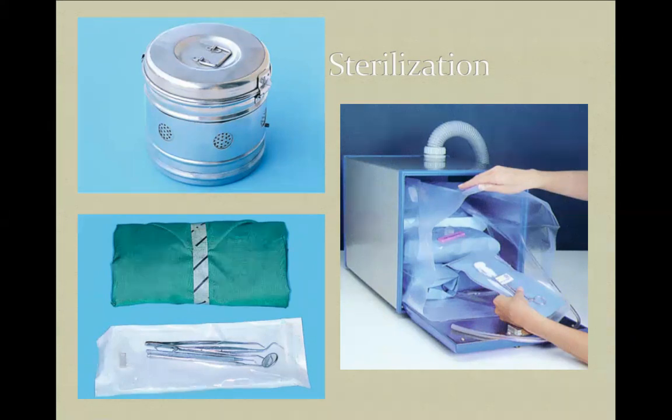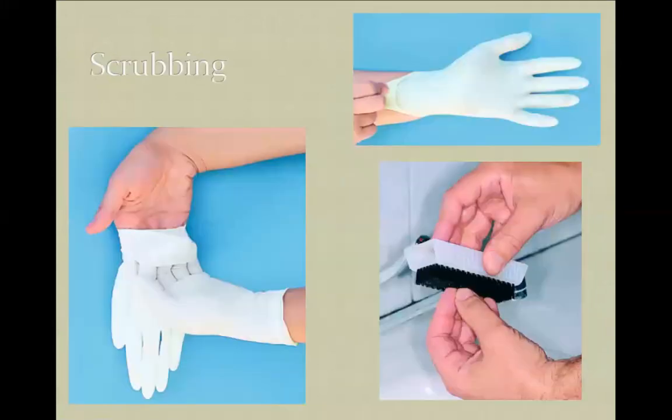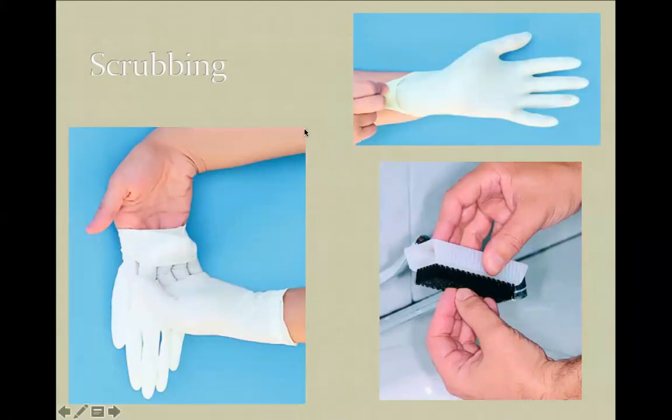The second very important thing is that dental implant placement requires a sterile environment only. It's like you're doing a real reconstructive maxillofacial procedure. So sterilization is very important. You have to use sterile instruments. You have to use sterile gloves. You have to cover the patient, and you have to use, as you can see, that was discussed. Just a kind of repeating.